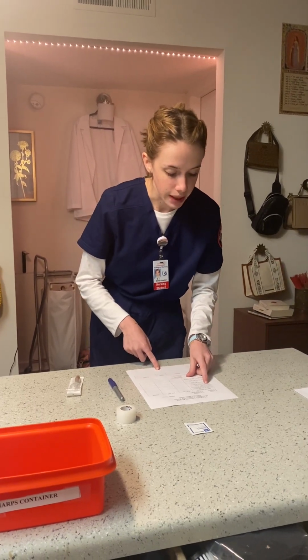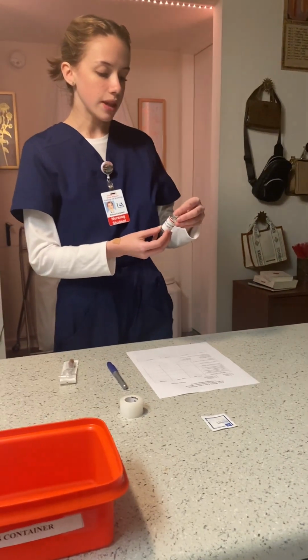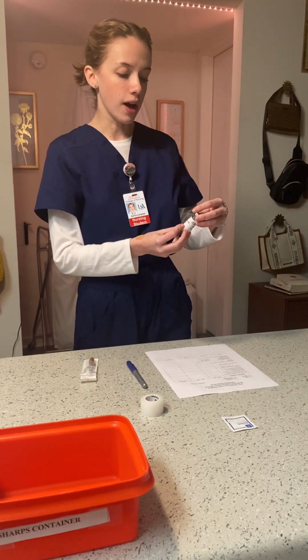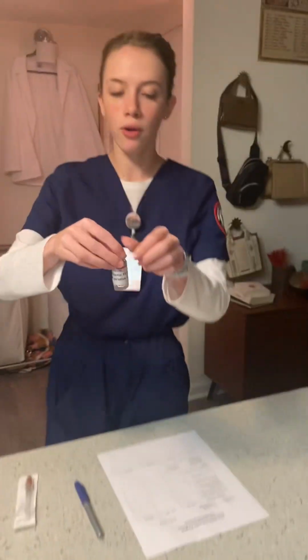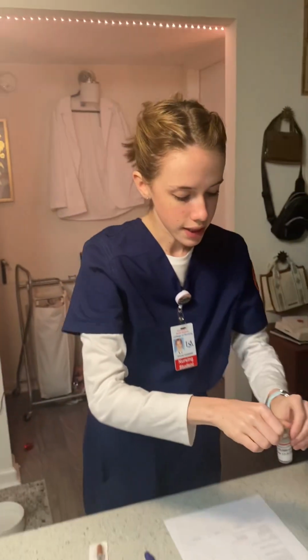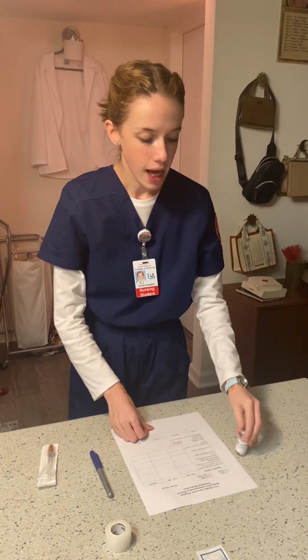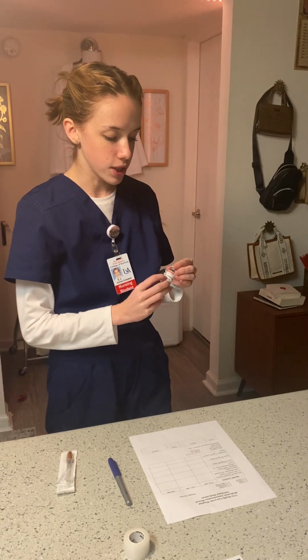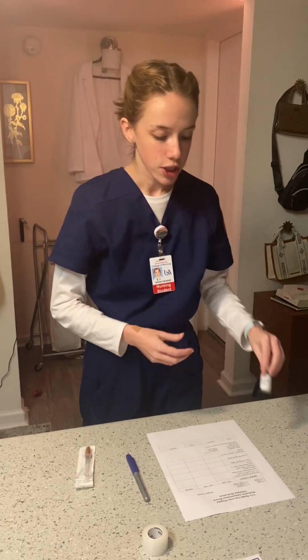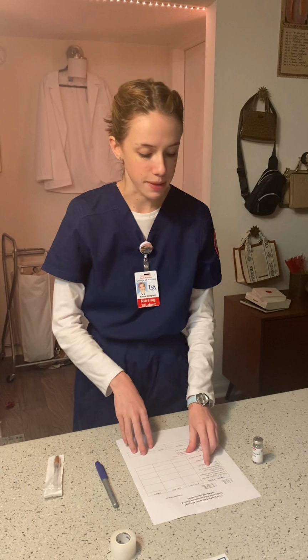I'm going to verify the medication, which is heparin, and I've got my heparin right here. The expiration date is 12/5/2025. I'm going to go ahead and show you the vial. All right. I'm going to verify the dose, which is 5,000 units. As you saw on the vial, we've got 10,000 units per every milliliter. So to calculate the dose, we would see that 5,000 units is going to be 0.5 milliliters, and that's the correct dose for this patient.